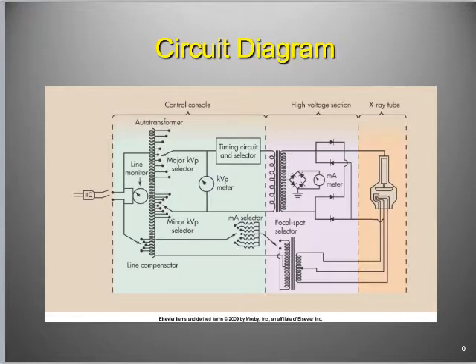So there's so much friction inside that filament, it does two things, or actually three. It starts to glow, number one. It gets really, really hot, number two. And it starts to emit electrons. The electrons are trying to figure out some way to get past this ridiculous filament. They are trying anything. They're even being boiled off into the air.